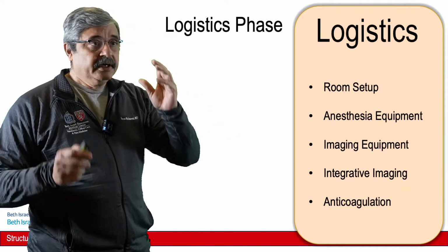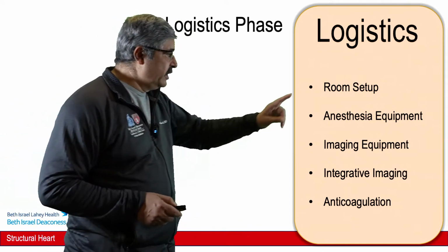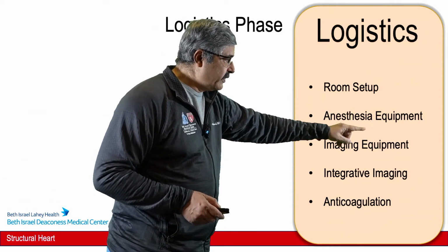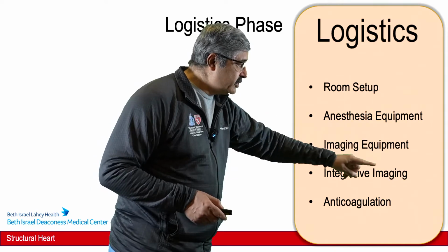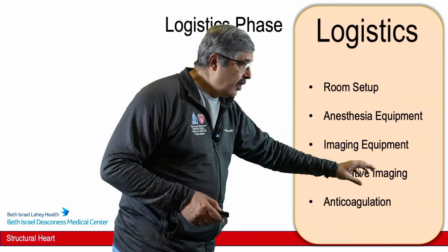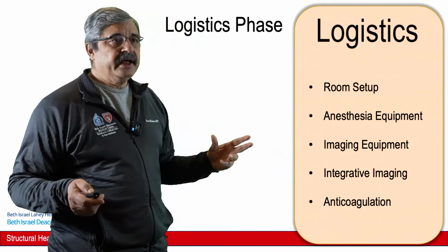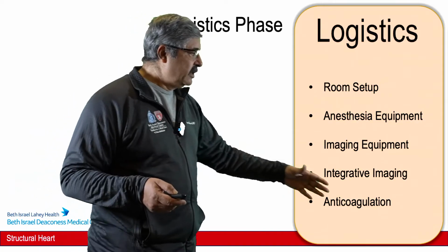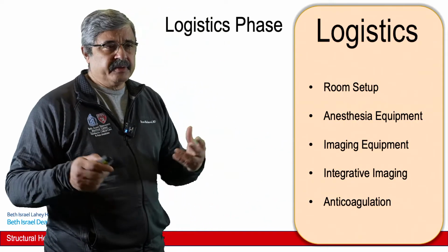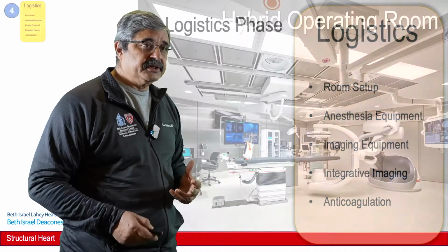So this is the duty of the structural heart disease fellow to see that the room, besides being set up for anesthesia, has anesthesia equipment that is perfectly fine. The imaging equipment is functional, is 3D capable, and can generate those 3D images. All the monitors are available, because unless the cardiologists see a 3D image, they cannot actually perform this procedure. And finally, the ability to anticoagulate, or any peculiarities in the patient, HIT, heparin resistance, all that kind of stuff, has to be factored in before you start this procedure.